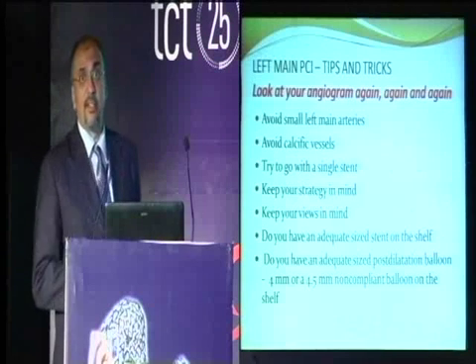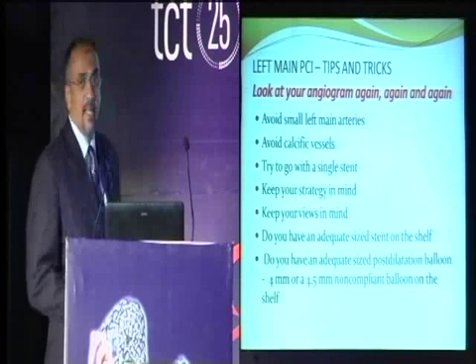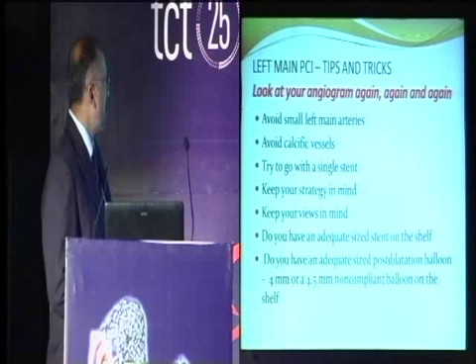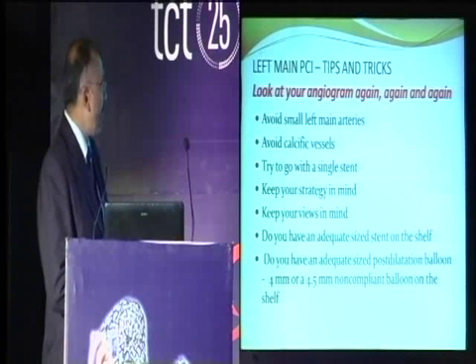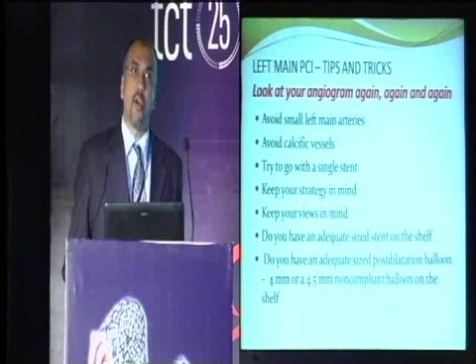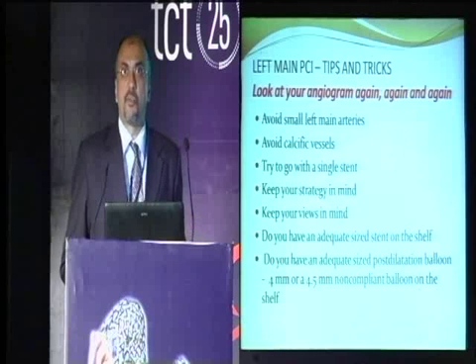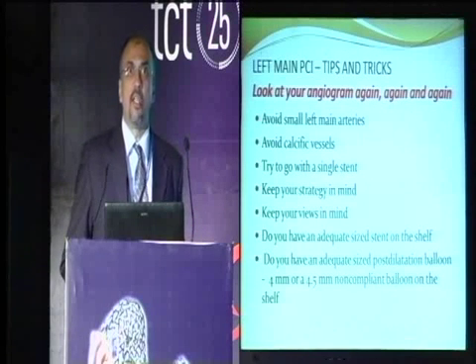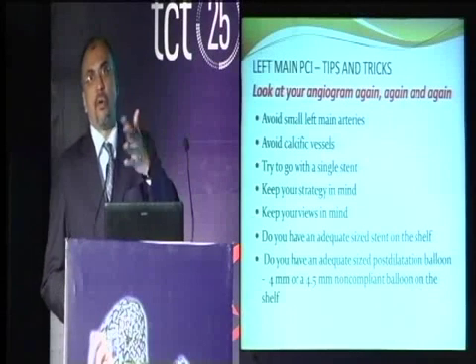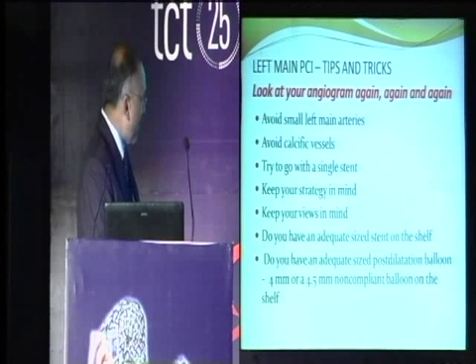So when you have seen your angiogram again and again, avoid small left mains, calcific left mains. Try to keep it to a single stent strategy. This is the best. Keep your strategy in mind, keep your views in mind. Make sure you have an adequate size stent. This is so common that if you have a left main ostium and you need a 12 millimeter stent or a smaller stent and you don't have it, you have only a 15 millimeter stent, then either you are hanging in the aorta or you are making it a bifurcation when it is not there. This is something very important.